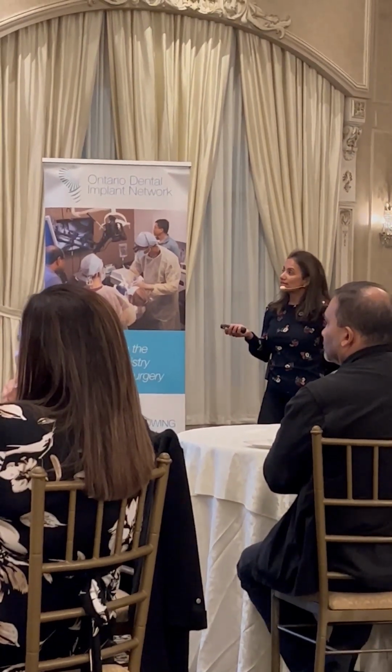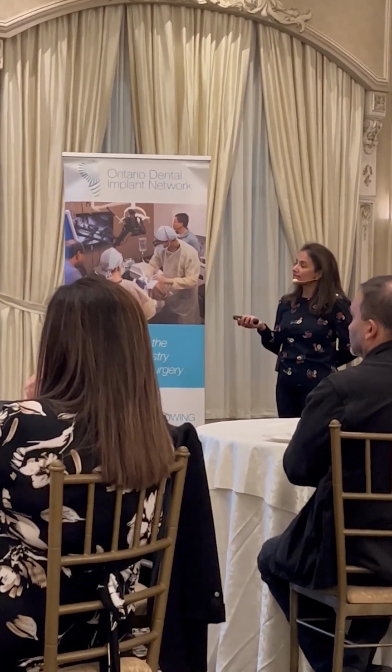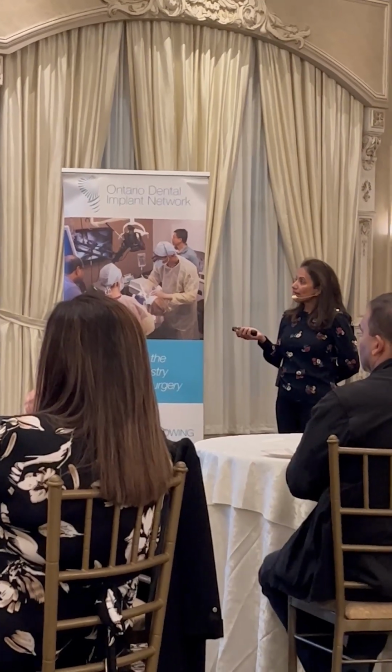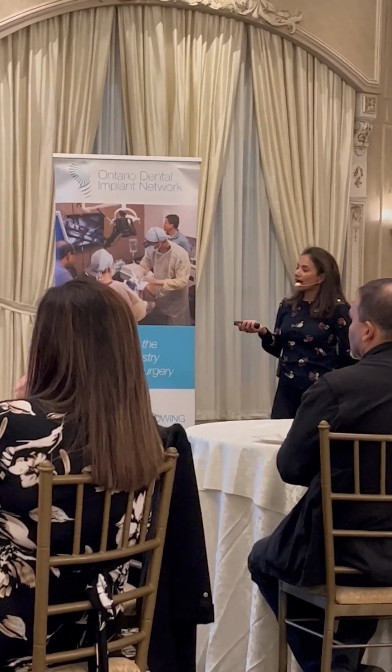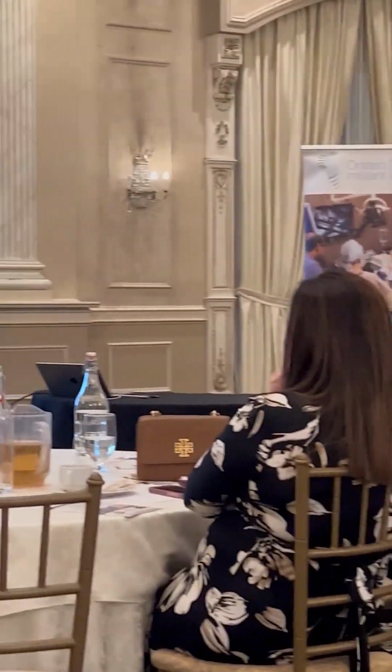Atraumatic extraction of 3/6 as much as possible. I first started off with the extraction of 3/6. The surgical guide placed, the Hiossen implants, ED4, the healing abutments, the jump gap filled with bone, the membrane, PTFE sutures, double interrupted sutures. This is just a slide showing how I extracted the mesial and the distal roots.